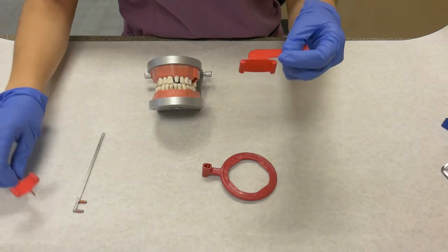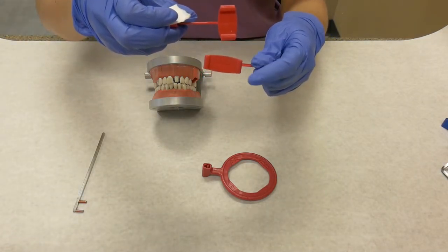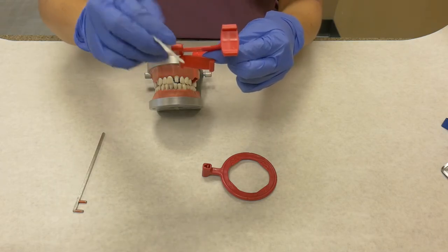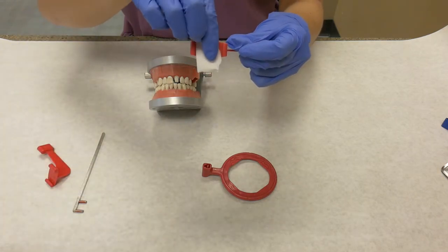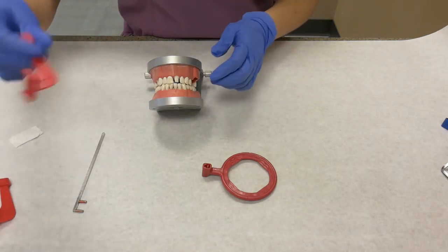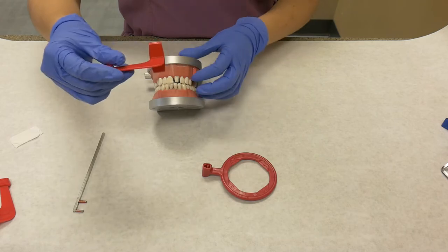There are two different sized bite plates for horizontal bite wings. We will use the larger one. The third bite plate is used for vertical bite wings.